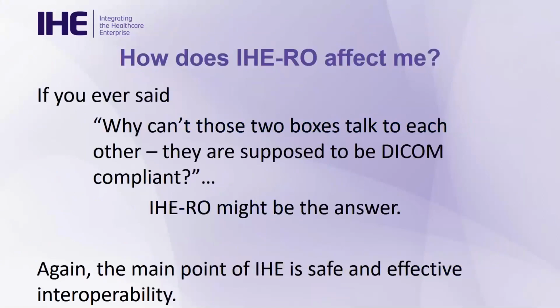So, how does IHE-RO affect you? And this is my statement. If you ever said, well, why can't those two boxes talk to each other? They're both supposed to be DICOM compliant. Again, IHE-RO might be the answer because it's a refinement of the DICOM. And I keep coming back to this, but the main point of IHE-RO is safety for the patient, safe and effective interoperability.